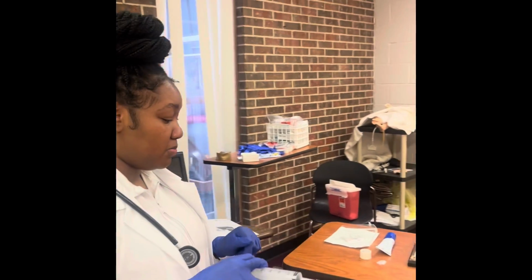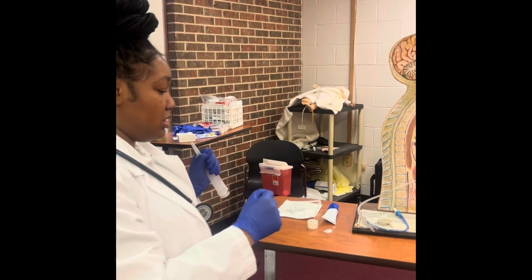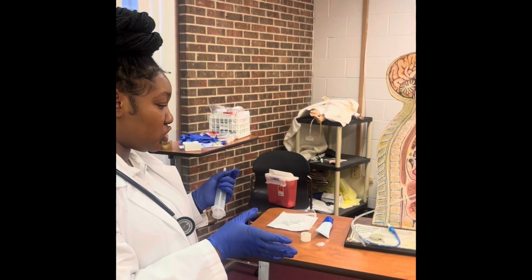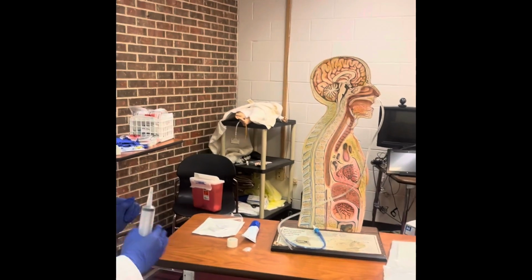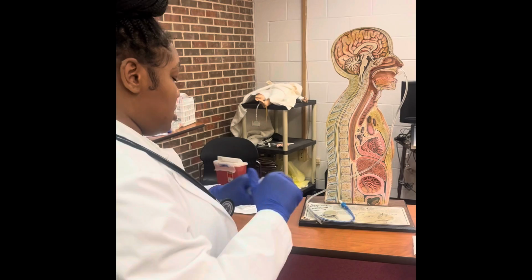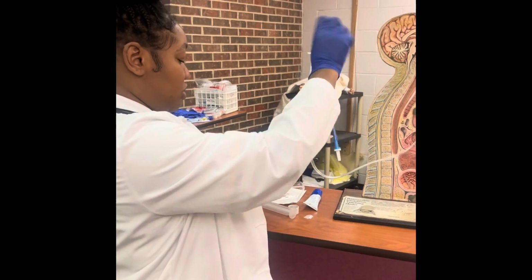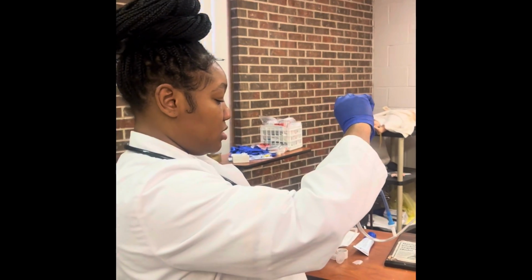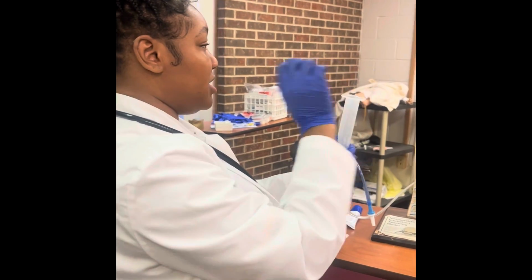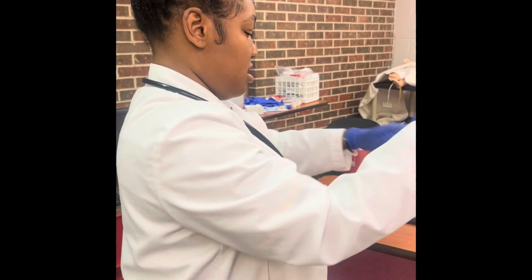Next, I'm going to be administering medication through the NG tube. I don't have the correct tools with me today, but I will get these. Whatever pills, liquid, laxatives, I will need pill cups, a pill crusher, some water, and the syringe. I will put each pill in its own cup, crush it, mix it with water, and then connect the syringe to the tubing. First, I would go in with some water, and then one at a time, I would put in the medication, go back in with some water, put in the next medication, go back in with some water, over and over again until I'm done. And then at the very end, go in with some more water and push all his medications in.